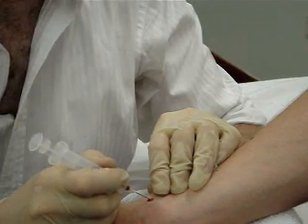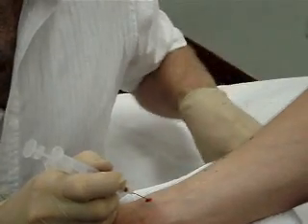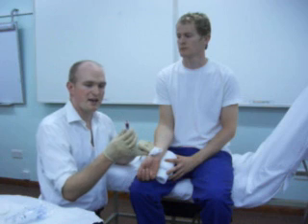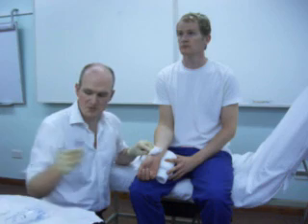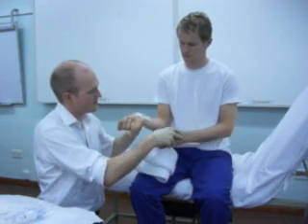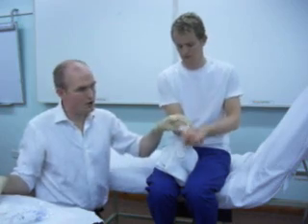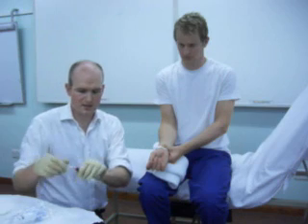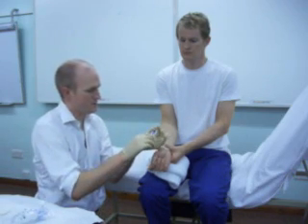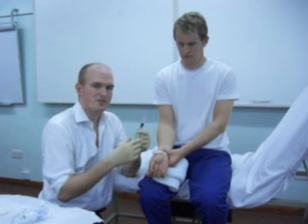With this procedure, as you go into the radial artery, a lot of the syringes will actually self-fill. I'm going to put a little bit of pressure over that area. That's the arterial gas sample — as you can see it's a nice red colour, and that signifies it's oxygenated blood. The important thing to do is to put a lot of pressure over the site because it's an arterial sample. I tell patients to put the hand behind it and press with a thumb firmly over the artery. To get the needle off, you can just untwist the needle, then pop the cap onto the syringe. This can then be taken straight to a blood gas analyzer and you'll have the results in 30 or 40 seconds.